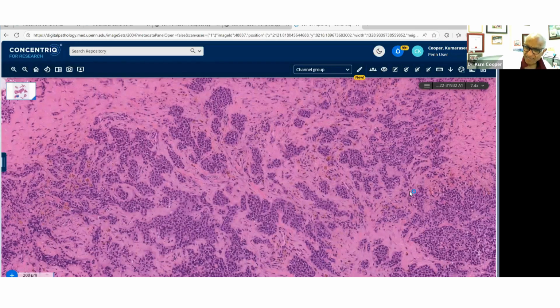So I immediately got myself a recut to share with you. Yeah, this is a clear cell sarcoma. And as you know, it was first described by the great Dr. Enzinger, what, 40, 50 years ago. He called these malignant melanoma of soft parts. I always like to give you the morphological historical terms because that tells you what this immunohistochemistry is. Melanoma, right? So you're going to have all of your melanocytic markers in varying degrees positive as well.